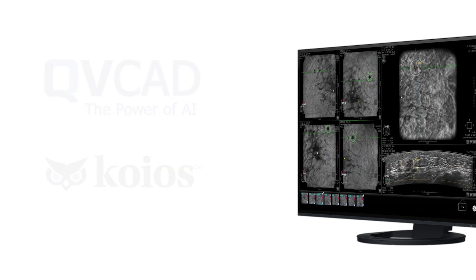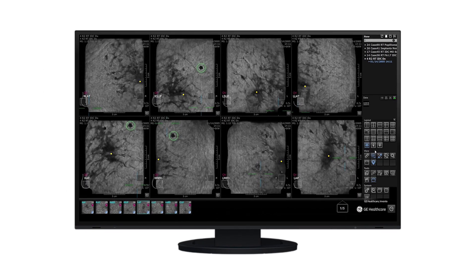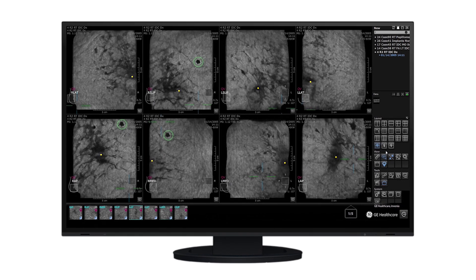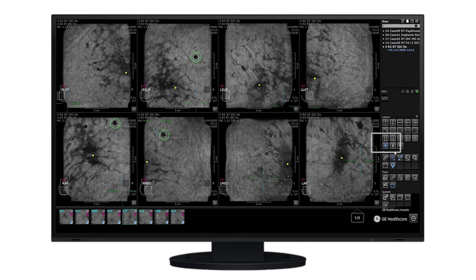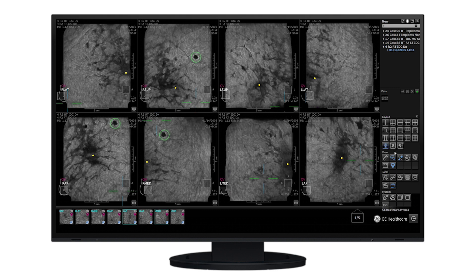The AI algorithms quickly process the A-Bus data and the entire exam is displayed in a single glance. Trained on over 10,000 cases, the CAD algorithms are able to identify and highlight characteristics commonly associated with cancer.